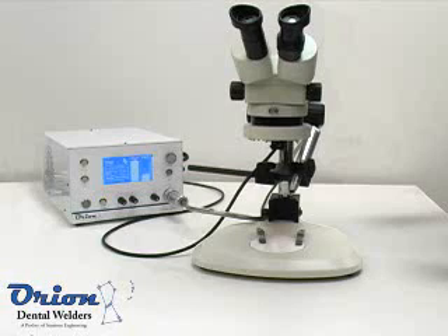The Orion Dental Welder is a 175 Joule Pulsark Welder and performs laser quality welds at a fraction of the cost.